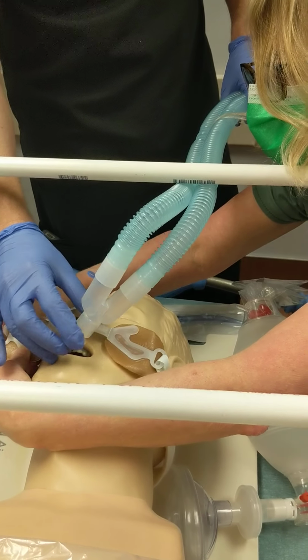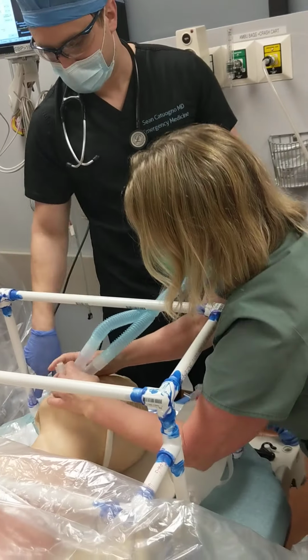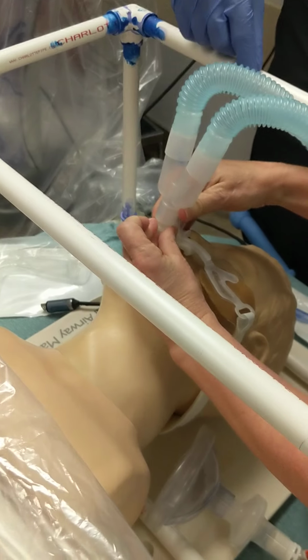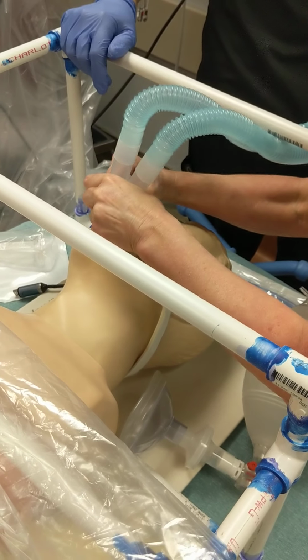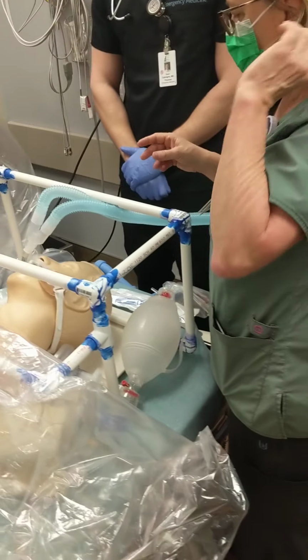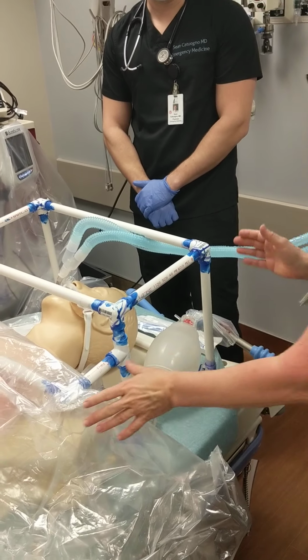This is where the actual setup for this thing becomes important, because it's not going to have these horizontal bars. The bars are going to be vertical, because otherwise you wouldn't be able to take this off without dislodging the tube. So now our tube is secure, and then we're done. We can take this out.